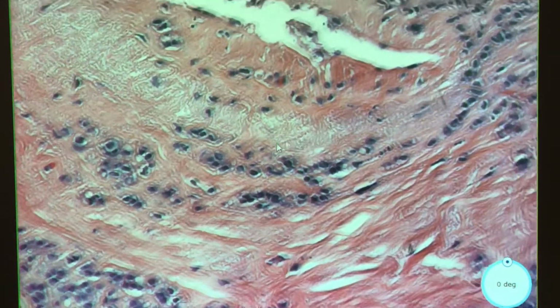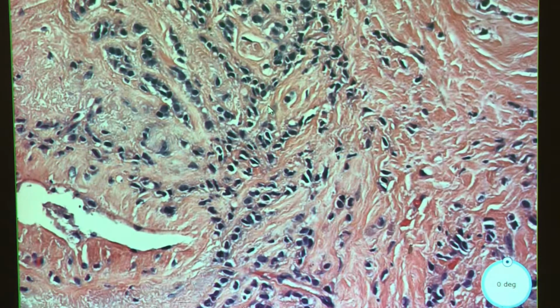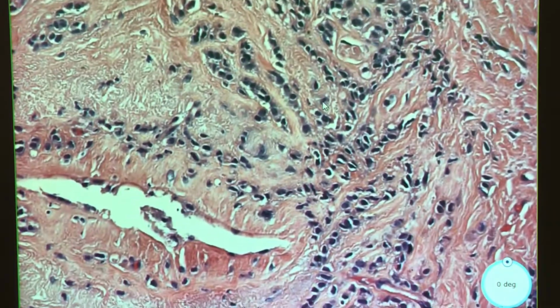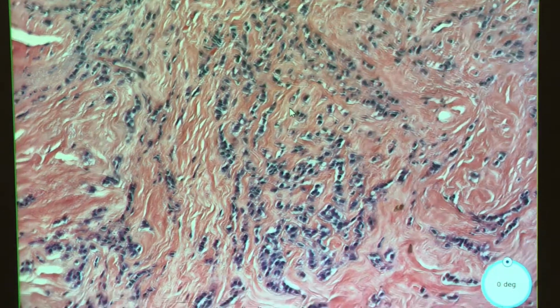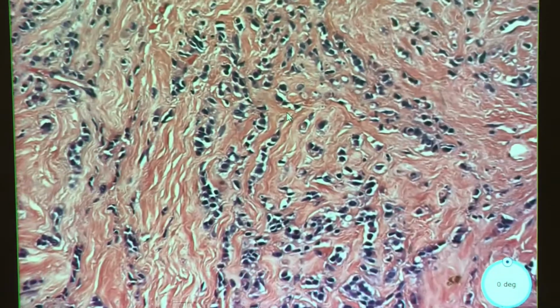But if anyone knows the answer, they can shout it out. If not, I can tell you guys. Okay, not hearing anything. Okay, so this is an invasive lobular carcinoma, and like we did, lobular carcinomas don't make ducts by virtue of their name, right? So it would be very unusual to give a tubular formation score of less than 3. So they get a 3.